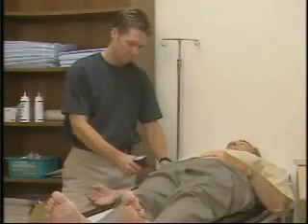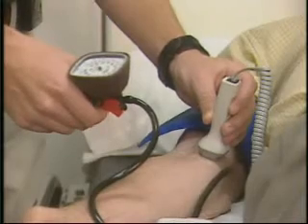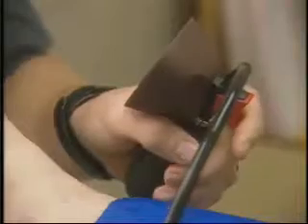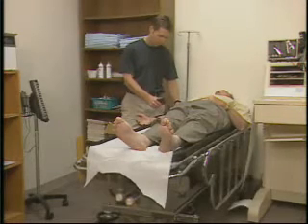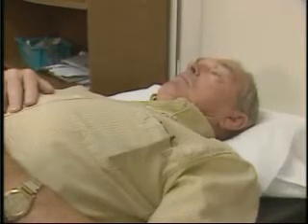The ABI examination is a relatively quick exam comparing the systolic pressures in the arm and the ankle. It can be done in the office using a simple handheld ultrasound Doppler and standard blood pressure cuffs. To prepare the patient for the test, have them remove their shoes and socks and lie quietly on the examination table for a few minutes in a warm examination room.